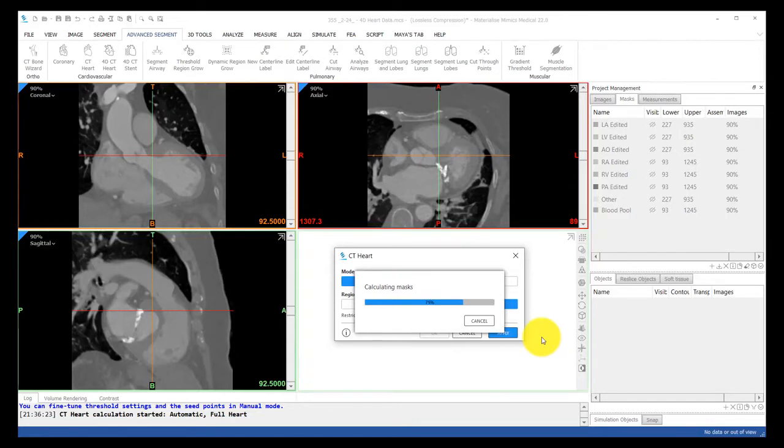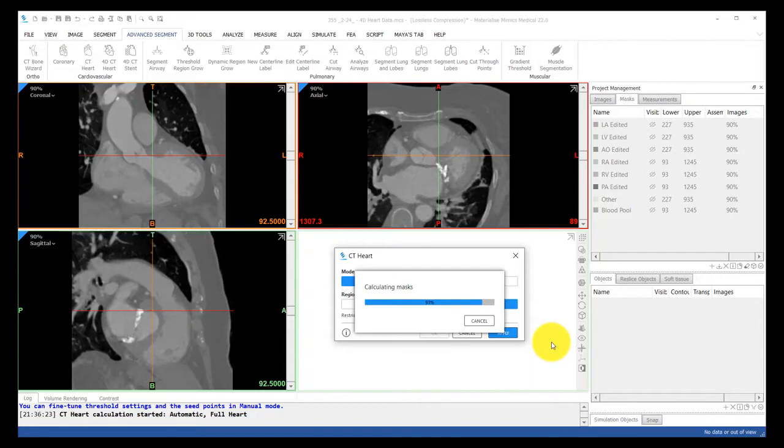I've seen this tool work on scans with scatter or artifacts, or like in this scan, calcium. But it's best if the scan at least has contrast in the heart.